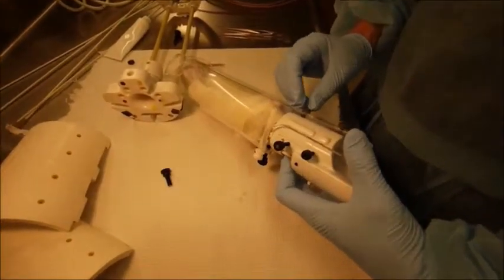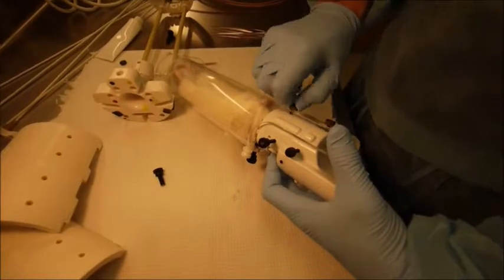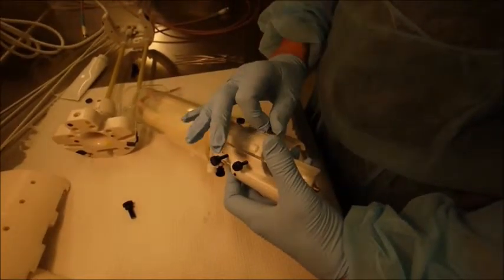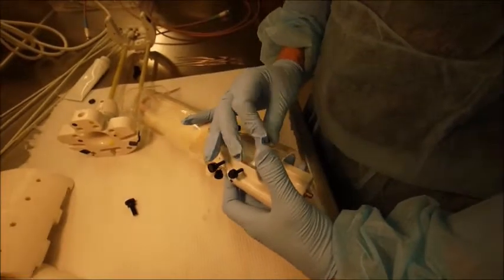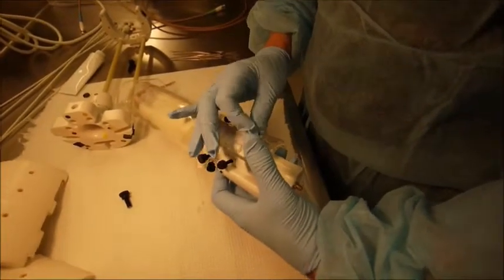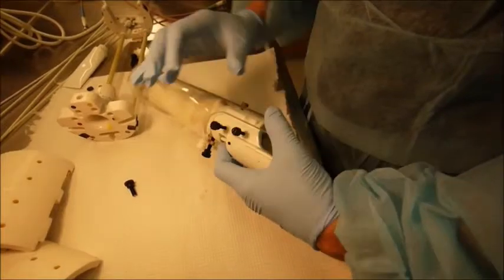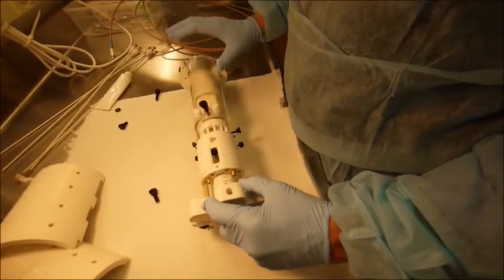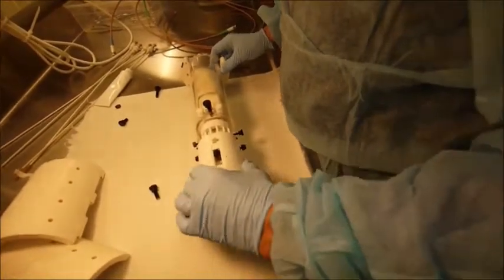Turn over the body tube and adjust the coil. Gently pull the coil away from the shoulder bars, slightly extending the neck of the rat. This further discourages movement of the animal. You can adjust the pressure on the head strap with the side screws. Be very attentive to the animal's respiration, as too much pressure can arrest breathing.